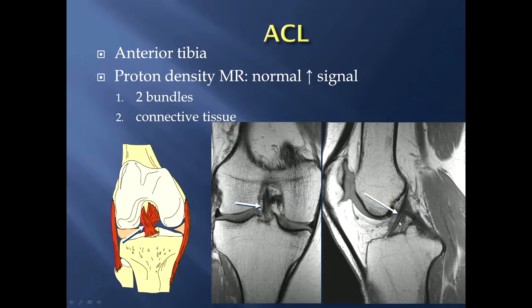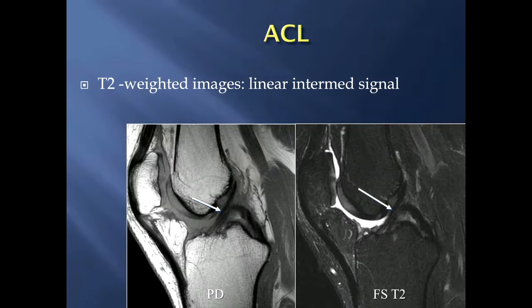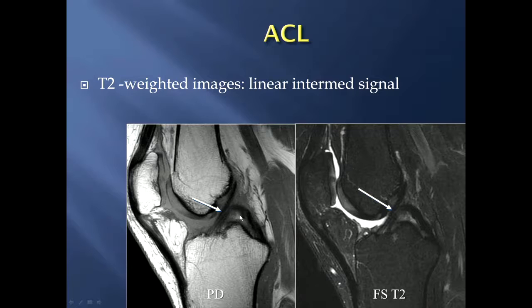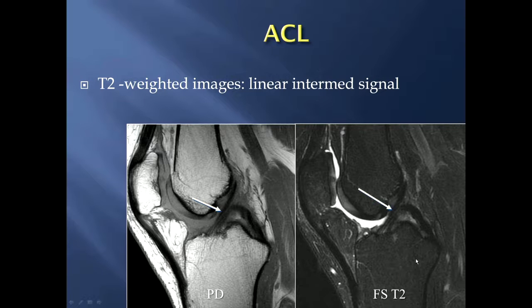One reason is that there are two bundles of the ACL, and you can kind of appreciate that appearance here. If you look at T2-weighted MR images, that signal darkens a bit but is still intermediate signal. Here's a different patient — a proton density-weighted sagittal MR image and the T2-weighted — and you can still see a little bit of the striations in a normal anterior cruciate ligament.